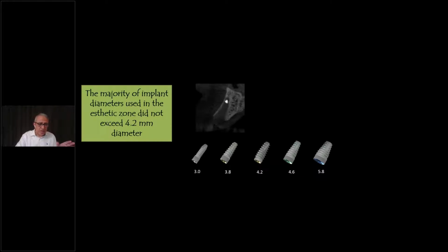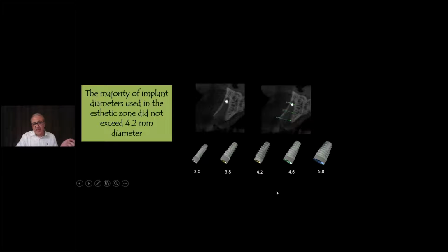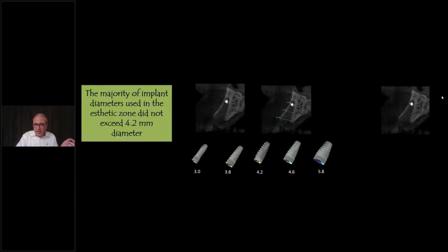And you need to realize that I've done a retrospective search for myself, not a study. For the past 5 years, I never placed an implant of more than 4.2 millimeters diameter in the aesthetic zone. You can see here, so you don't even think twice about using more than 4.2 millimeters diameter in the aesthetic zone. That's something that we know for sure now, and I want you to take this step back home with you.